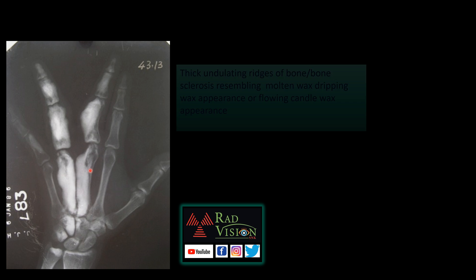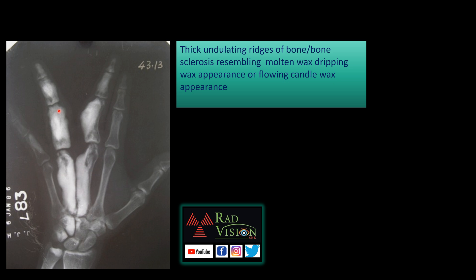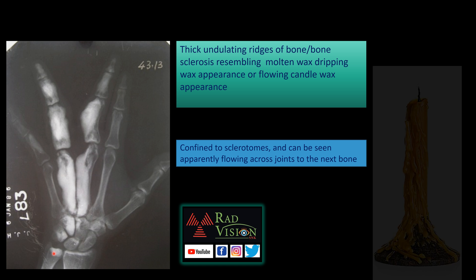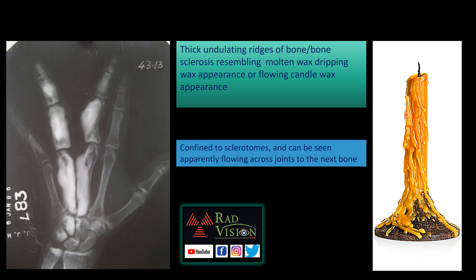The next case shows thick undulating ridges of bone sclerosis typically involving the metacarpals, carpal bones, and phalanges. This is in a sclerotomal distribution and crosses joints to involve adjacent long bones, mimicking a candle wax appearance.